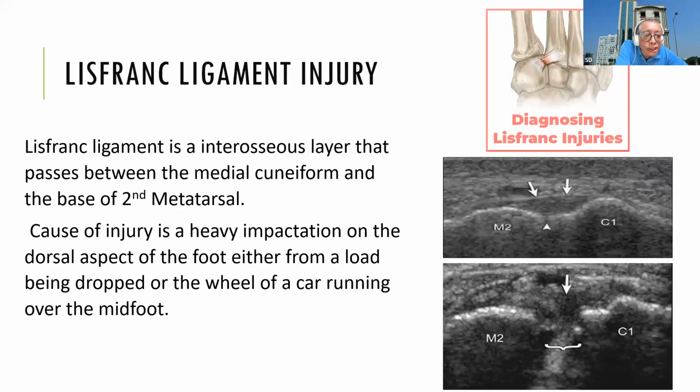So another ligament injury that can occur in foot is Lisfranc ligament injury. This Lisfranc ligament injury is one of the common ones in sports persons, and it is the condition which can cause mid-foot pain in the athletic group of persons. So this Lisfranc ligament, as you can see in this picture, basically extends from the cuneiform bone to the base of the second metatarsal. So it travels obliquely. Okay, you can see this is the Lisfranc ligament, which extends from the cuneiform bone to the base of the second metatarsal.